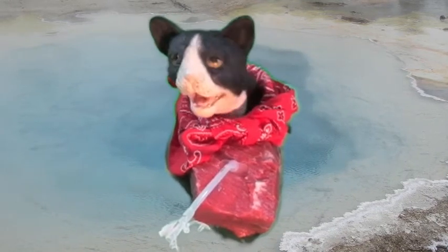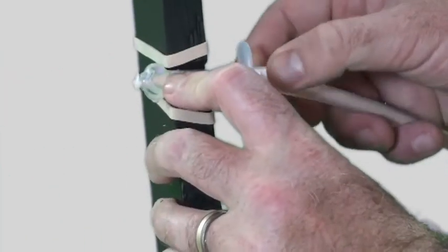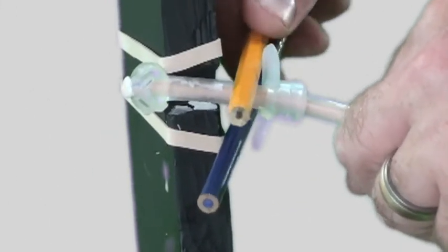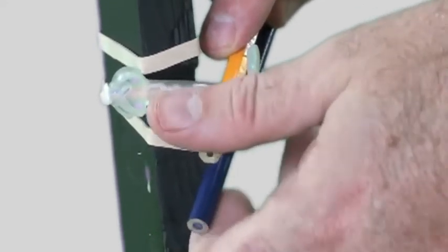It didn't work, though. We can also try breaking up the clog a little bit. Usually, feedings get crusted right at the abdominal wall. We can sometimes slide back the bolster a little bit, and then take two pencils or two syringes and firmly but gently squish the tubing over and over again, trying to crunch up any clog that's in there before you try flushing it again. Well, what if that doesn't work?